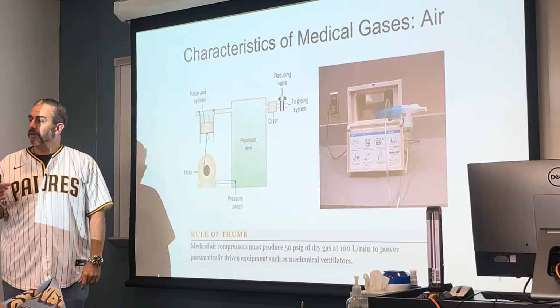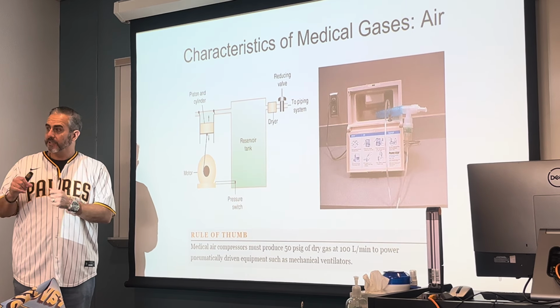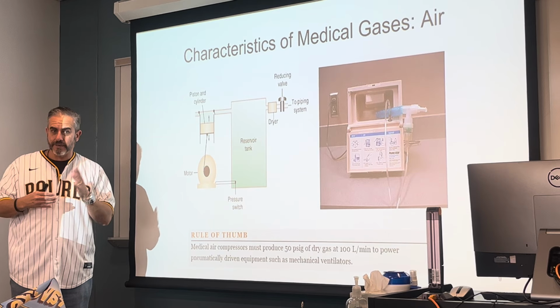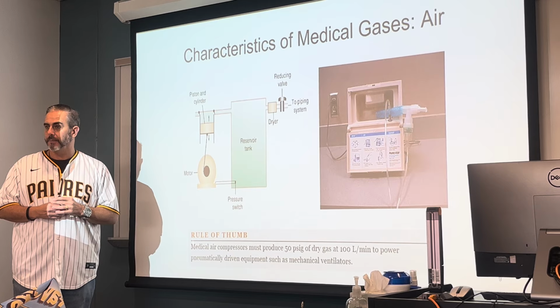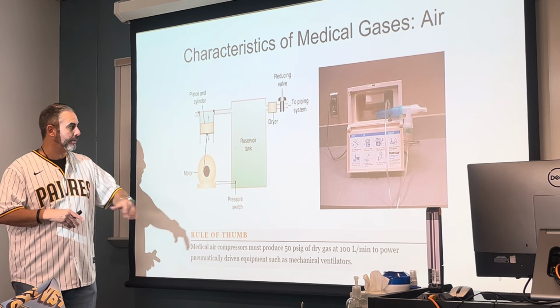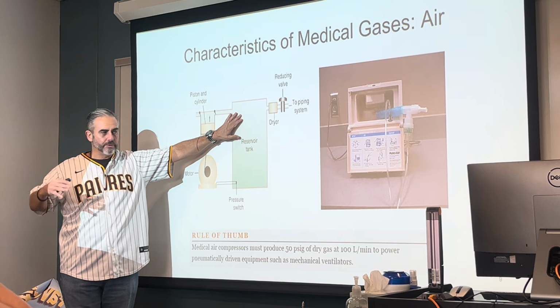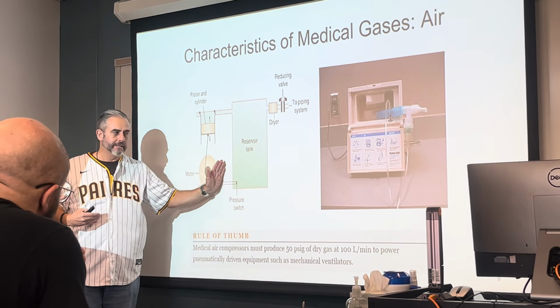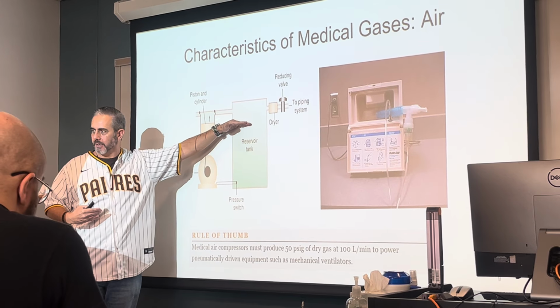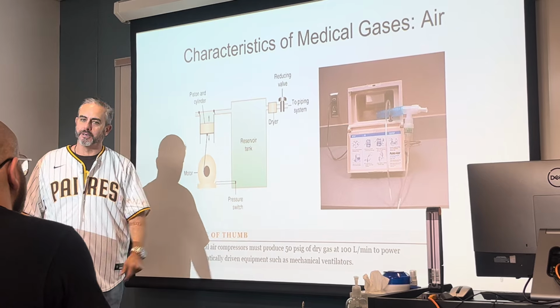And I can't help but notice when you guys are in the lab doing activities, and you're using the medical grade air, I can hear the compressor on the roof powering up. It'll fill that tank, and then it'll shut down. And you guys will use it, you'll start bleeding this off, and it knows when the level gets to a certain point, it better kick on again and start filling this up with room air. And I can't help but notice that I can hear that motor kick on upstairs.